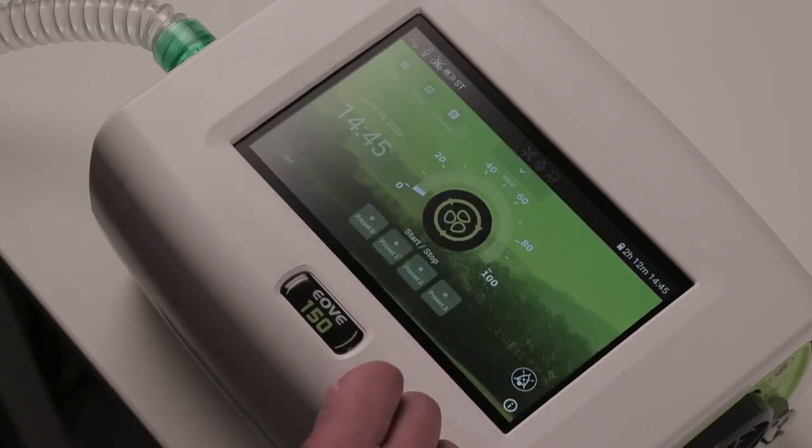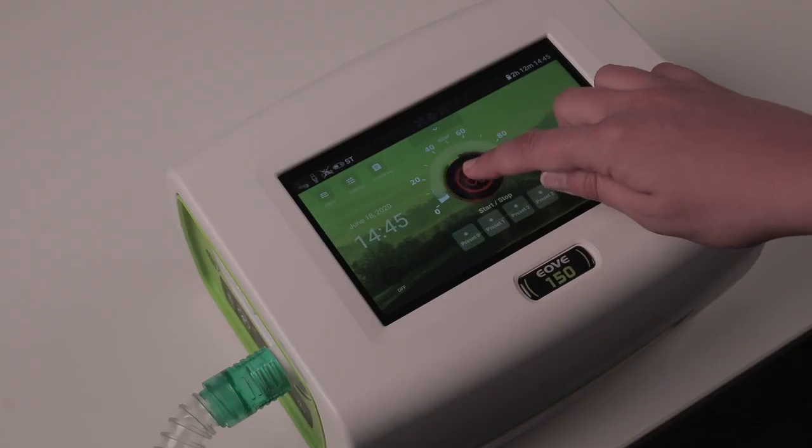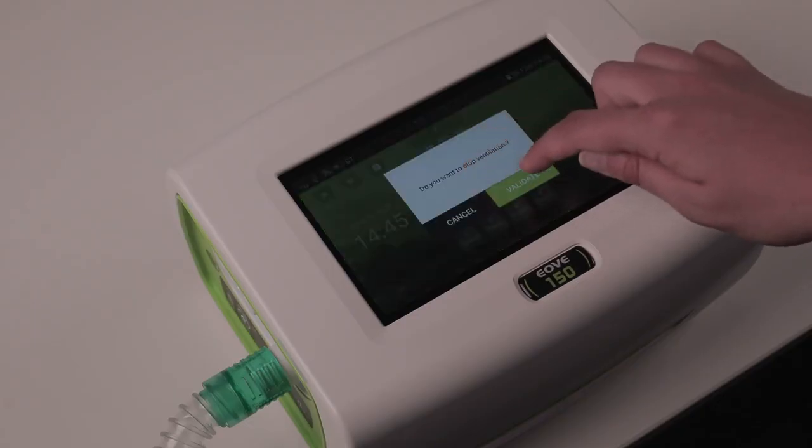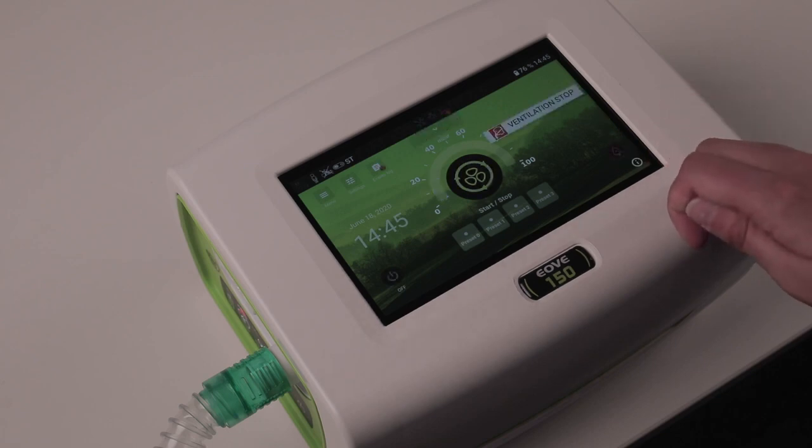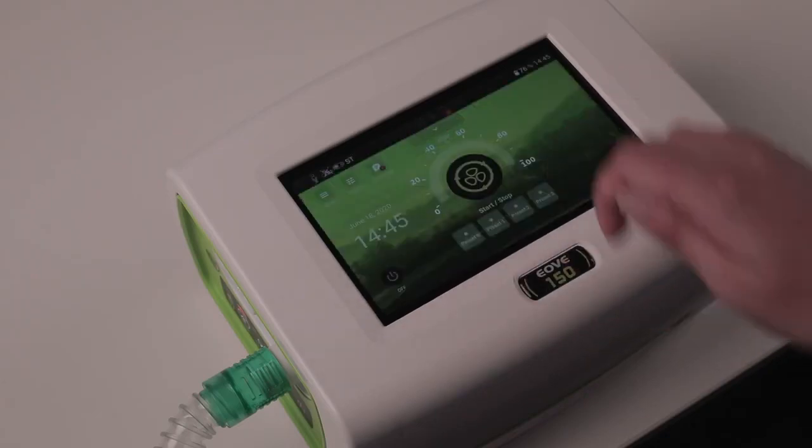To turn off the device, you have to first turn off the ventilation. Hold the start and stop button and validate. The blinking turbine icon shows you that the device is in standby mode. You can turn off the device by using the off button on the bottom left of the screen. Hold this button and validate.